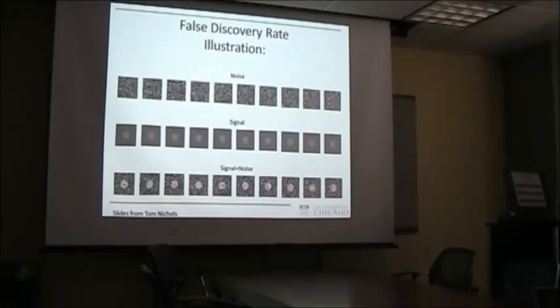So suppose you have images with pure noise, randomly distributed noise. And you have images with signal. Here in the middle, there's some signal, these brighter spots, right? If you add these two, and again, this is two-dimensional, your actual fMRI image would be three-dimensional, but just for this example, it's a two-dimensional image that has some signal here in the middle and some noise outside. Does that make sense? Yeah?